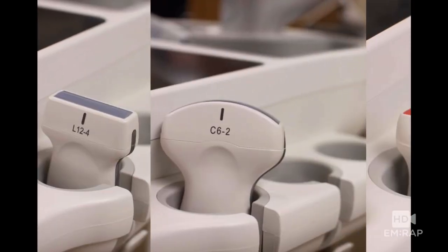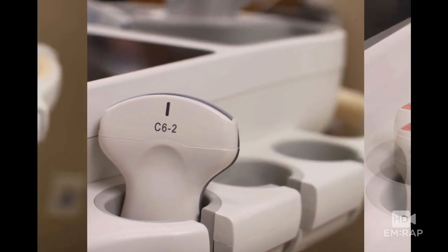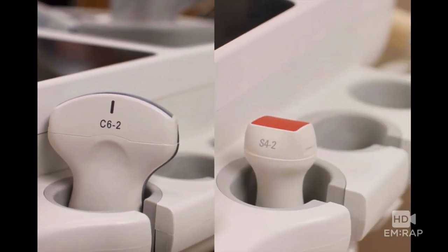What we're going to talk about today is how you can use ultrasound to identify pulmonary edema. For this exam, you can use any of the three main ultrasound transducers, but my favorite probe for this is going to be the curvilinear probe. If you don't have the curvilinear probe, the phased array will work just fine.